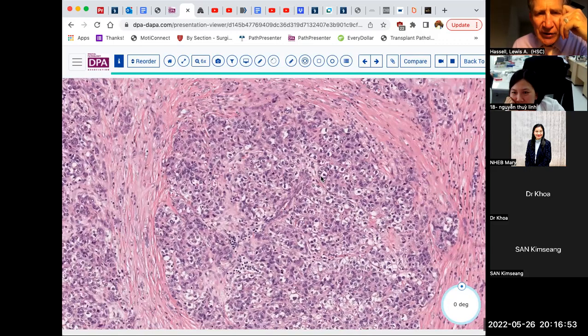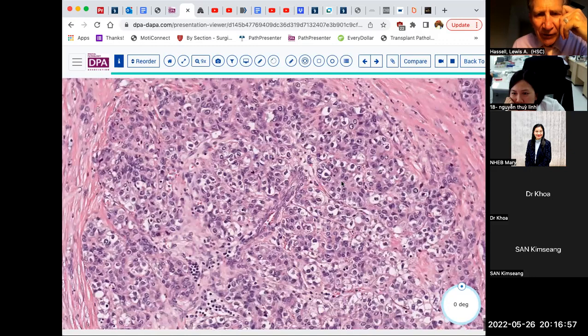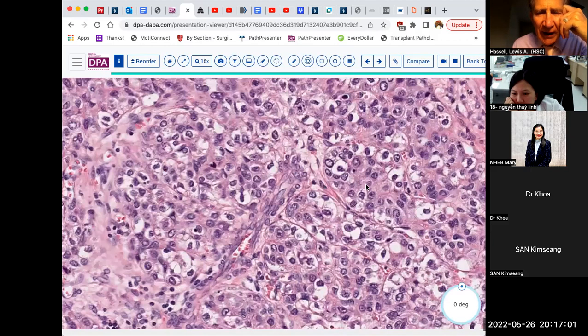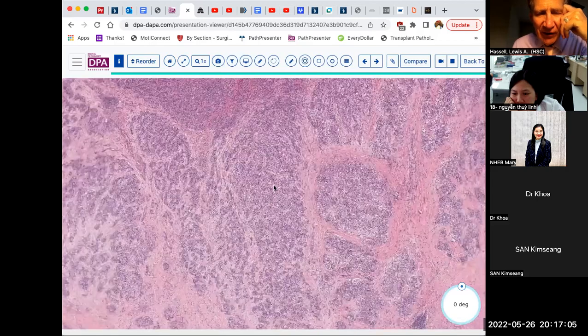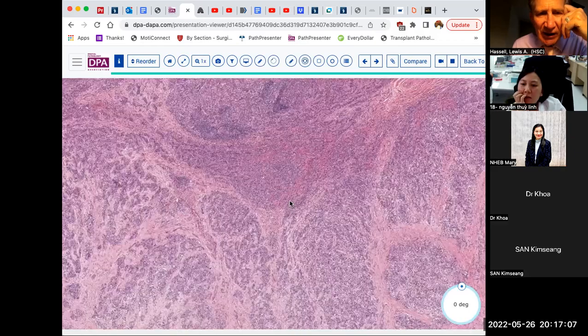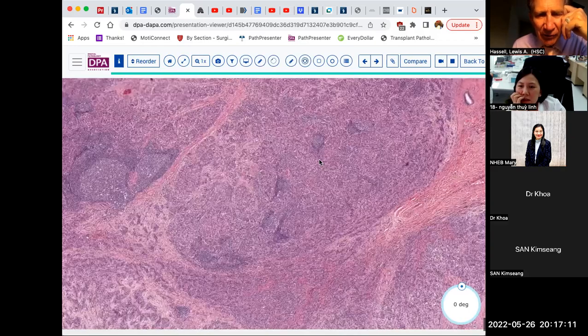But even in doing so, it's like you've got red marbles and white marbles, so there's a little bit of a difference here. And again, immunohistochemistry would probably be the most useful thing in a situation like this, to see if you were actually getting differential expression.